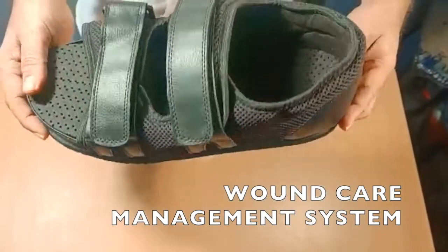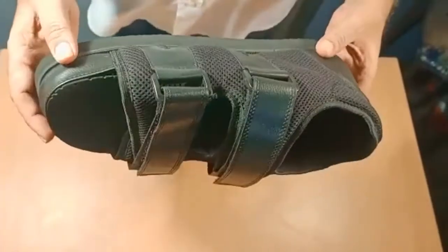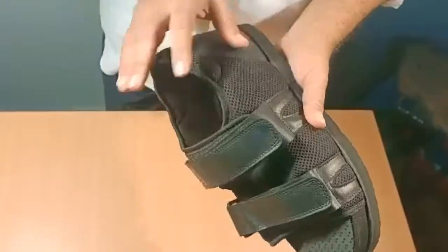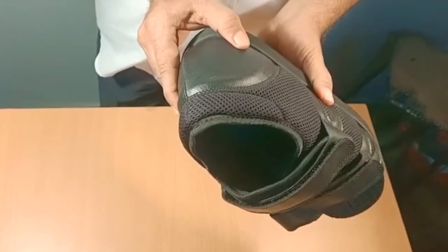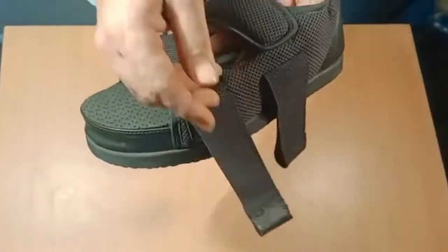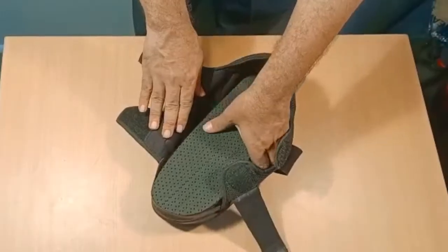Introducing a new wound care management system. This system has a tough and lightweight outer sole made of soft breathable material and a tough heel counter. The dual strapping system enhances stability and ensures proper fitting.